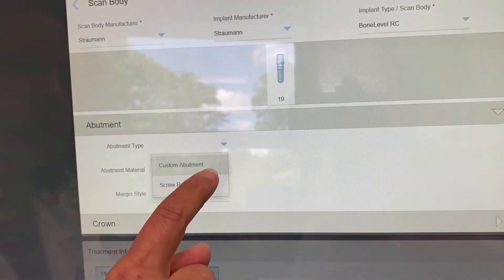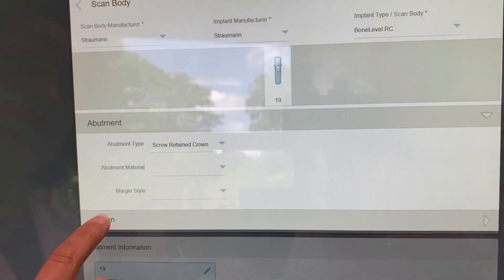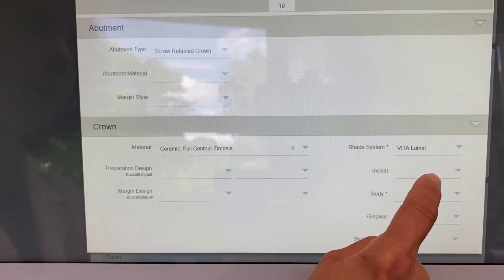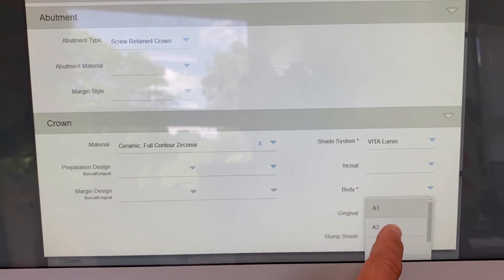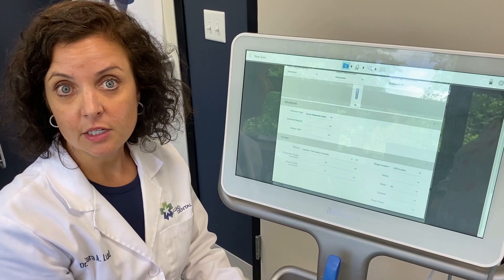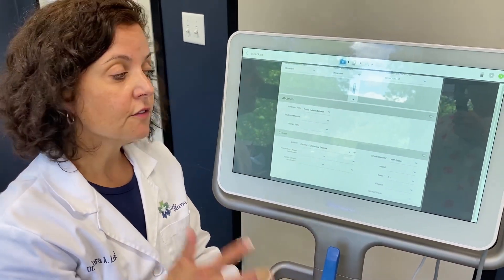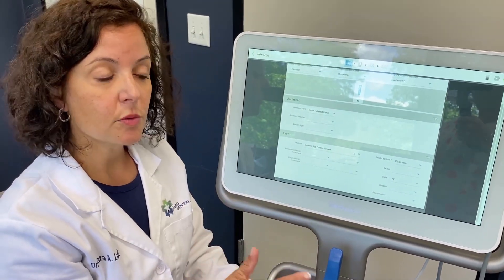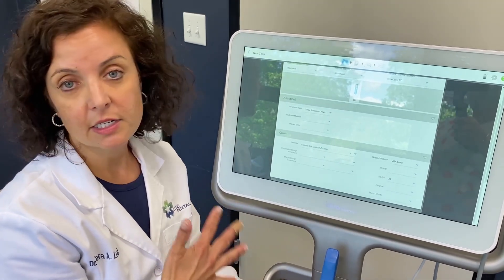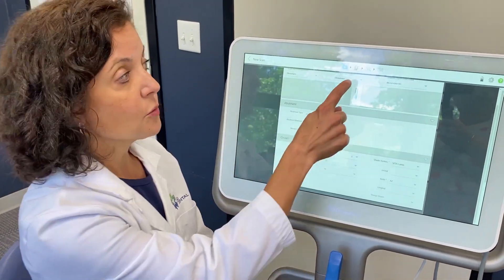We're going to do a bone level RC here, and select what kind of abutment — we're going to do a screw-retained crown. For the crown, we're going to do a full contour zirconia, Vita shade A2. The only part that can't be done prior to the patient is the shade. So as soon as the patient is seated, the first thing we do is determine the shade to make sure all this information is accurate. After scanning, if I need to go back in and edit it, I easily can.